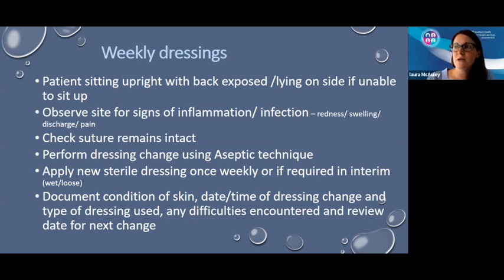So there are two different types of nephrostomy tubes that get put in. One is called a Cook nephrostomy tube, where there is a little connector on the end that has a self-locking mechanism. So when the radiologist puts the nephrostomy tube in, they then pull this string and tighten it around the locking mechanism, and that actually sutures the tube in place.